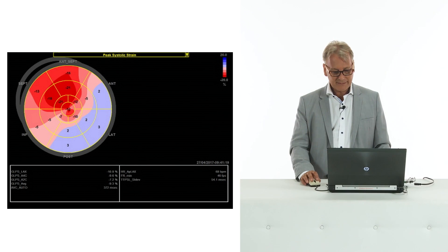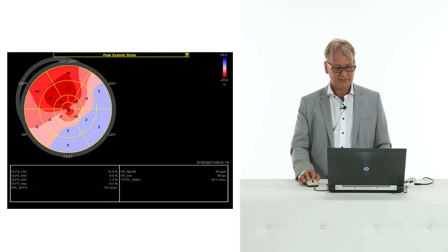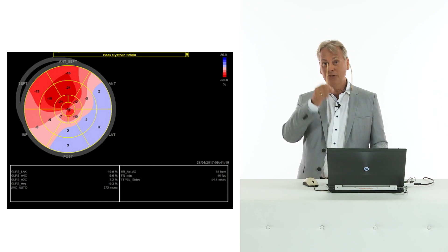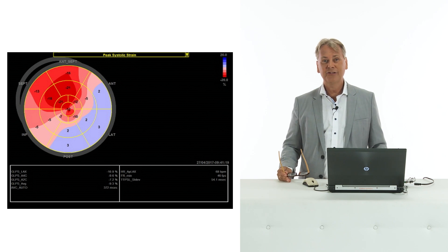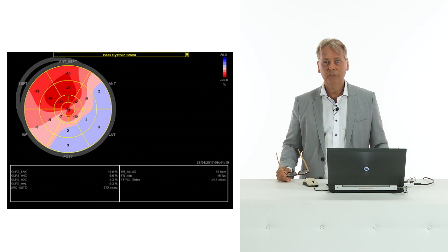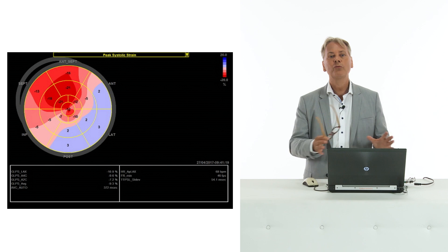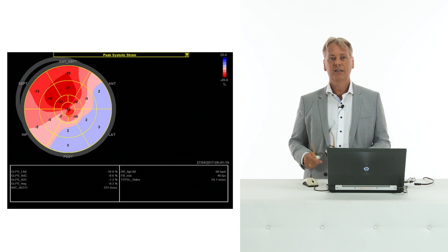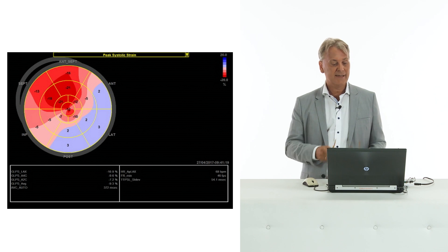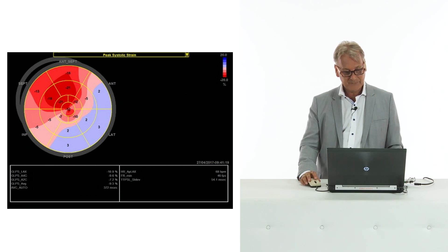This clearly indicates the presence of viability. Here is the strain analysis of our patient. Did you expect such a poor strain, which is so regionally distributed as in this bullseye display?